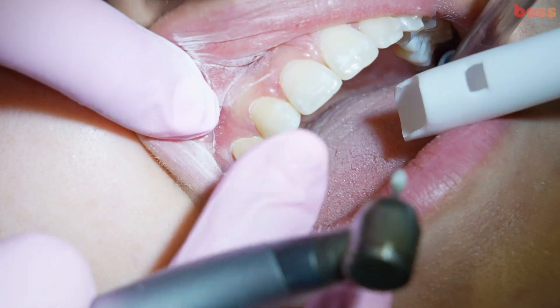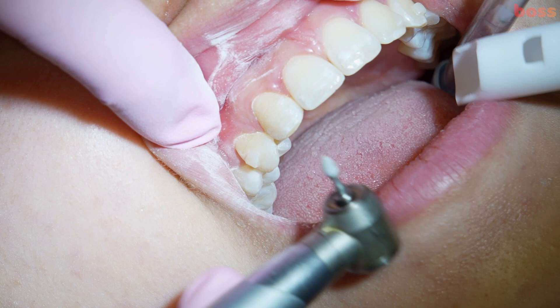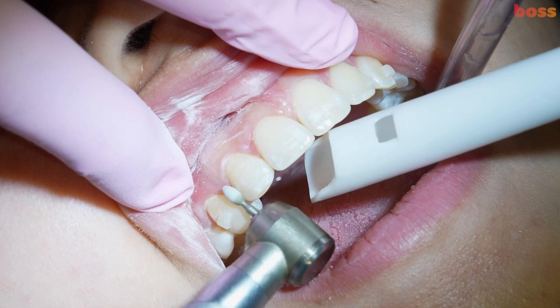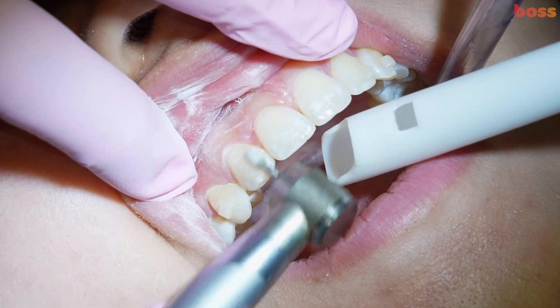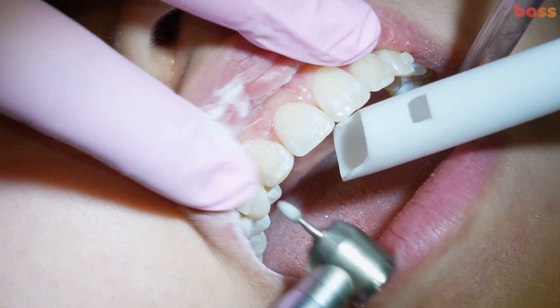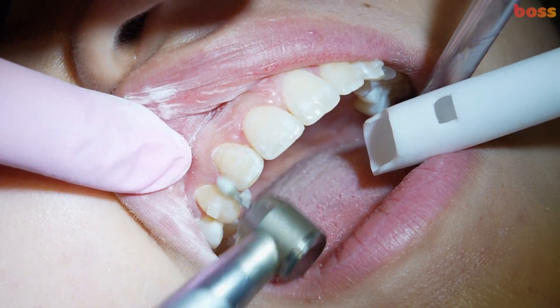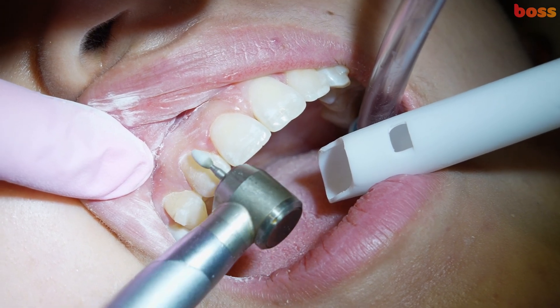What I'm doing now is getting the labial surface to have less convexity so it starts to mimic a lateral incisor. I'm going right at where it's the most convex.